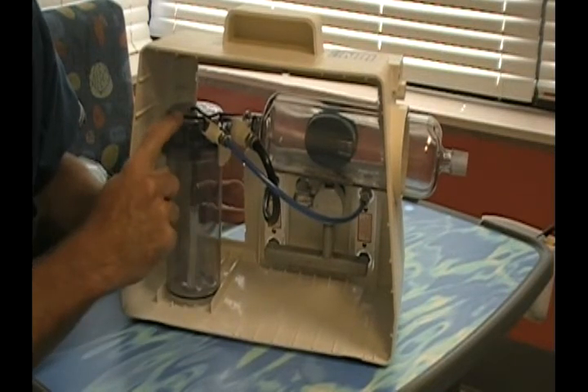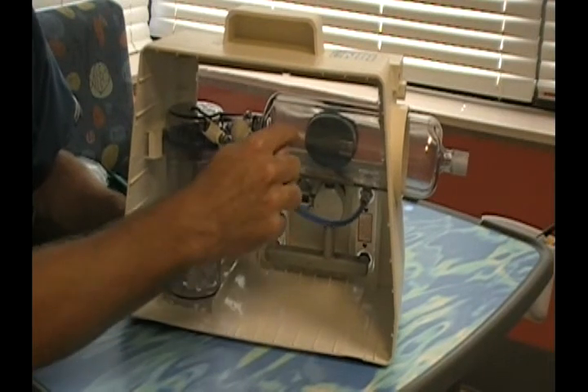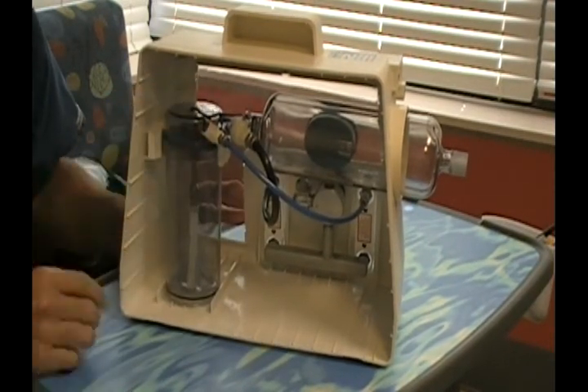The blue hose connects to the nebulizer — this is the nebulizer flow meter. This is the drying chamber flow meter. And this is the drying chamber that seats onto the O-ring.